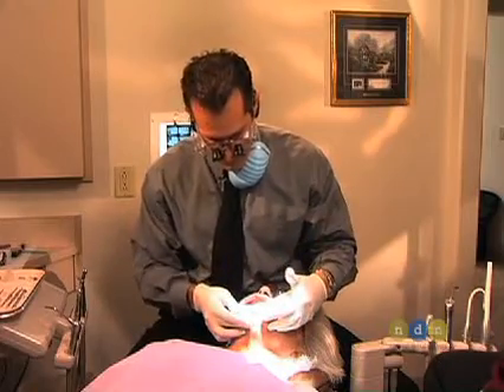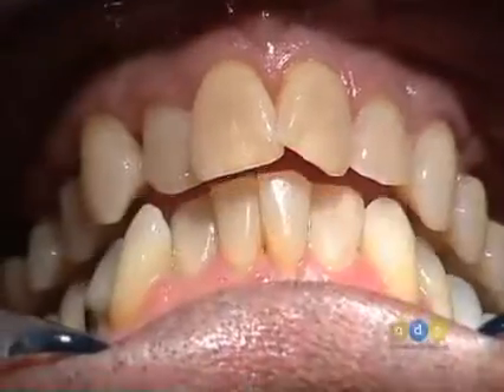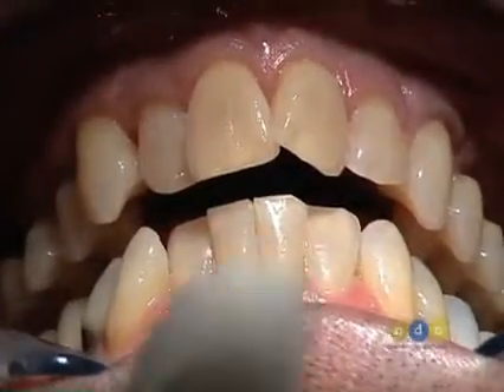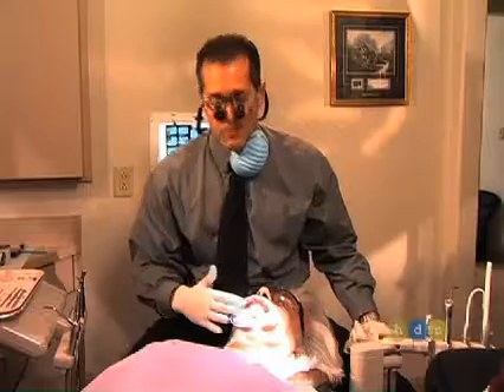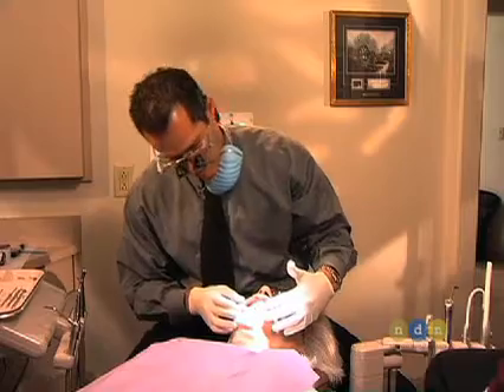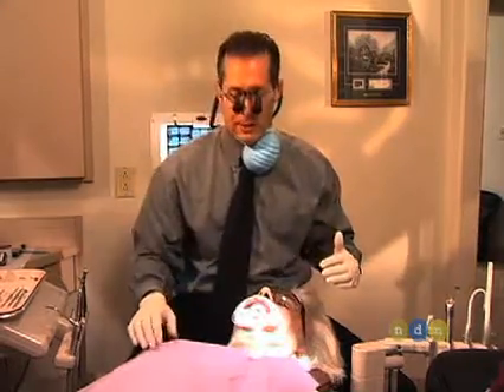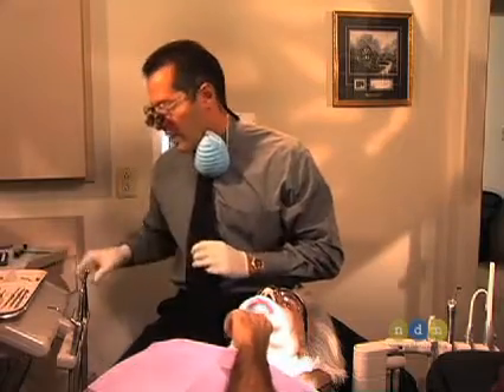The first thing in creating this case is we want to create an ideal upper arch form. To do that before we even prep, we're going to recontour the arch form to ideal contour, then we're going to place depth cuts to remove the proper amount of tooth structure for the porcelain, and then we will just finish up the preparations. These will all be bonded porcelain restorations, and it will create a beautiful look.